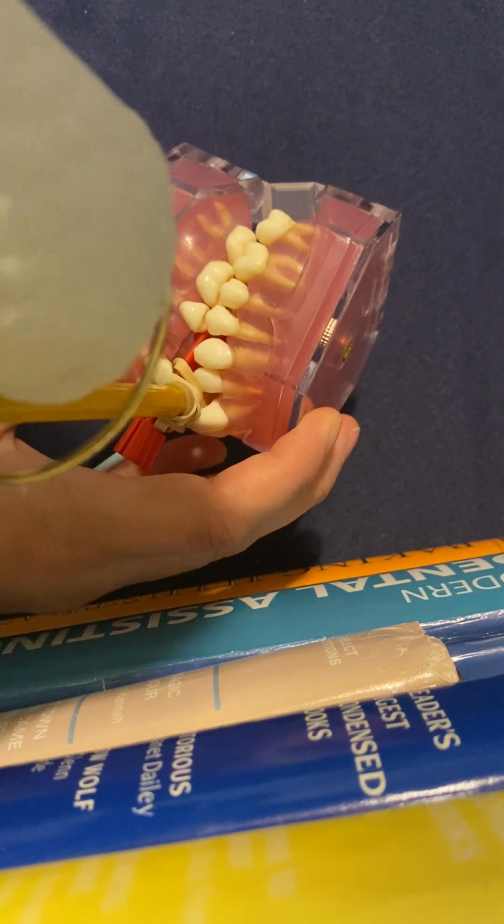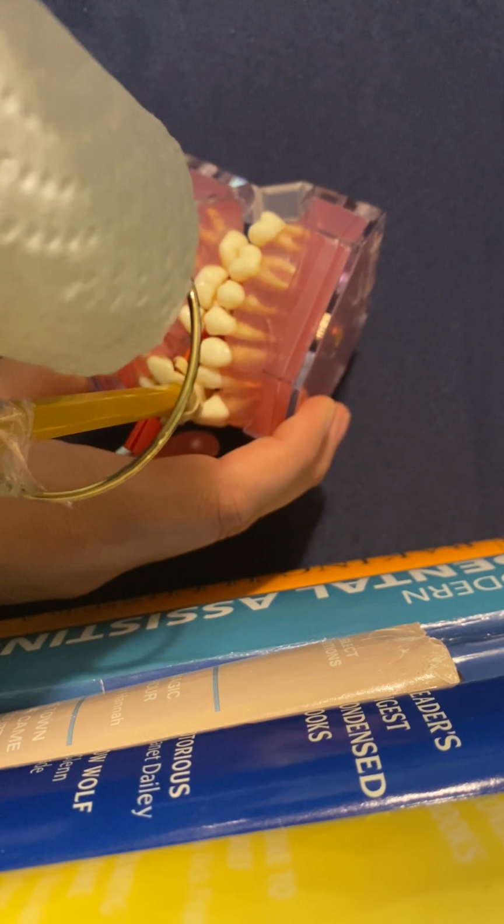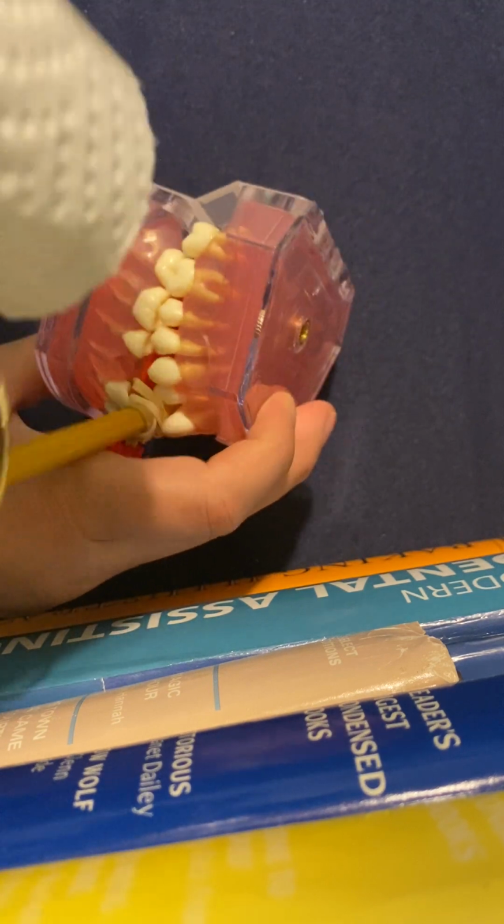And then where you're going to point the central ray for the molar shot is down from the outer corner of the eye to the occlusal plane. The outer corner of the eye. So for bite wings for molar shots, you're going to want to line it up straight. I'm going to show you on me because it's easier. You're going to want to put it straight with the corner of this part of the eye, and for premolars you kind of want to line up with that part of the eye. So just to try and shed a little light on that.